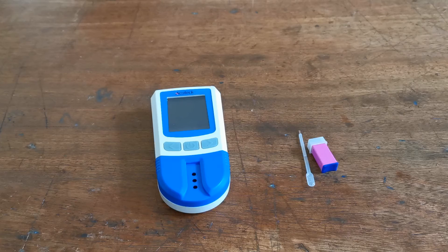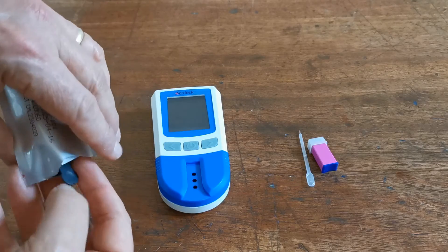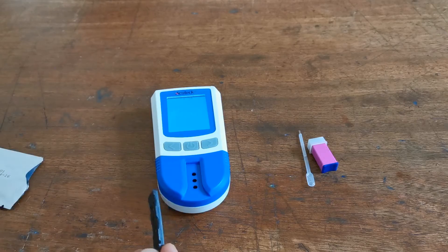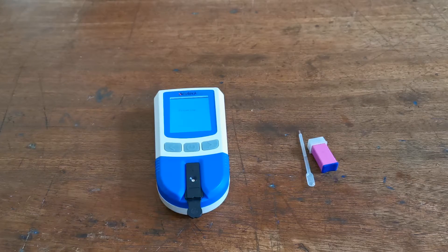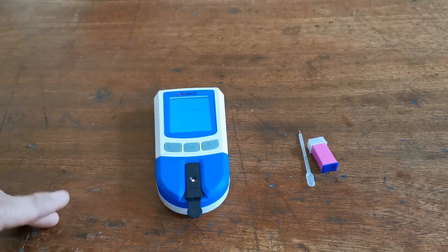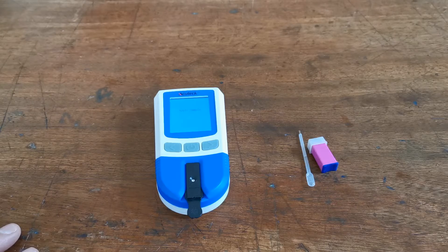When you are happy with capillary flushing and ready to sample, remove the test device from its protective foil, press the power button on the meter, and insert a test device matching the code chip. You'll see the device display 'preparing' and then a blood sample indicator will flash, showing the device is ready to take the blood sample.